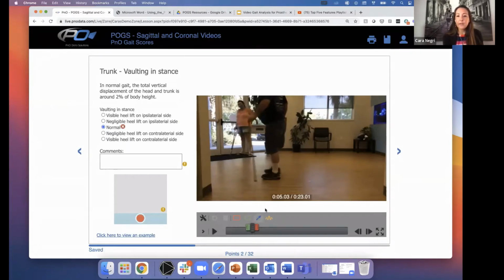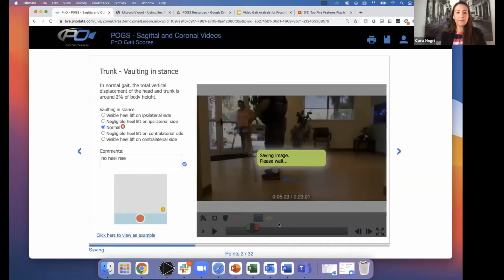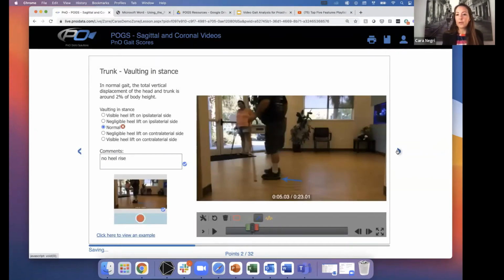screenshot here. And again, something just very simple. I can just point and say no heel rise. And we'll just take a screenshot. All right.